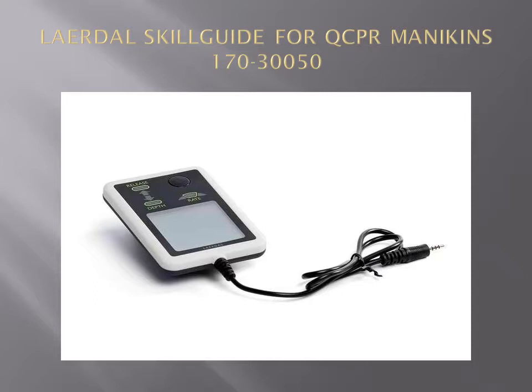The Skill Guide unit also gives you native feedback in the form of a compression score, ventilation score and flow fraction. It is small, portable and lightweight.